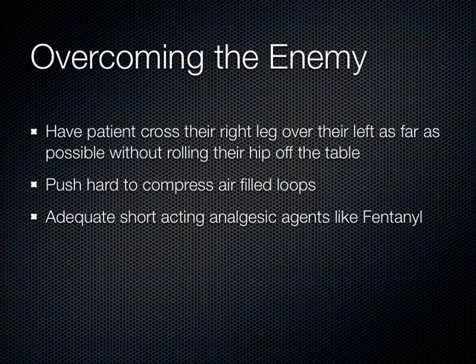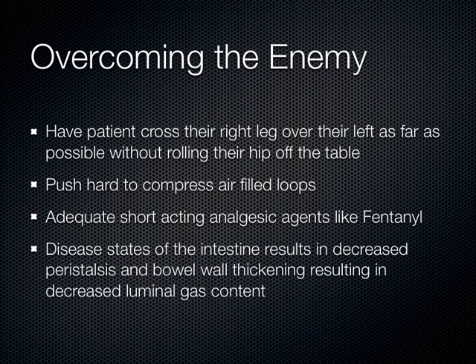So I go in the room with the nurse and say, okay, you push the fentanyl, I'll start the ultrasound, because it starts working almost immediately when you push it. And then you'll see, sometimes you have to use two hands to do this compression. And again, I keep coming back to this. When you have a disease state that reduces the amount of peristalsis, there's more bowel wall thickening, and there's less intraluminal gas, and all of this makes it easier to visualize the intestinal contents.